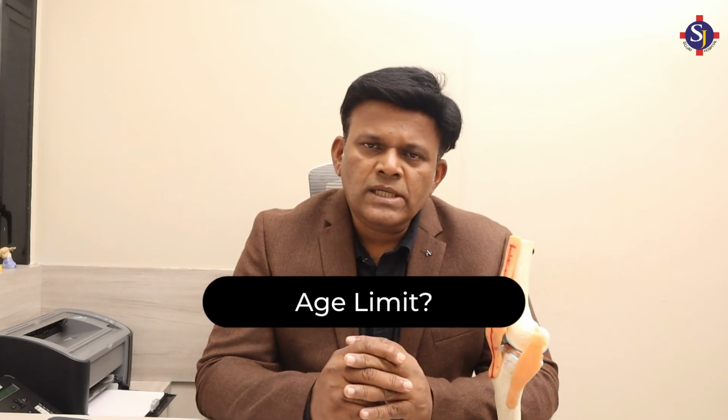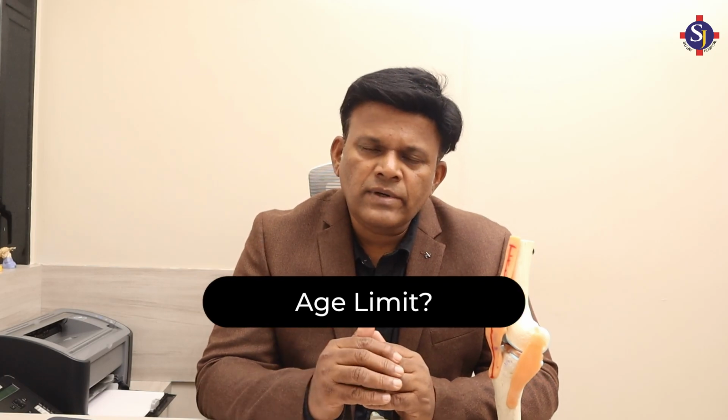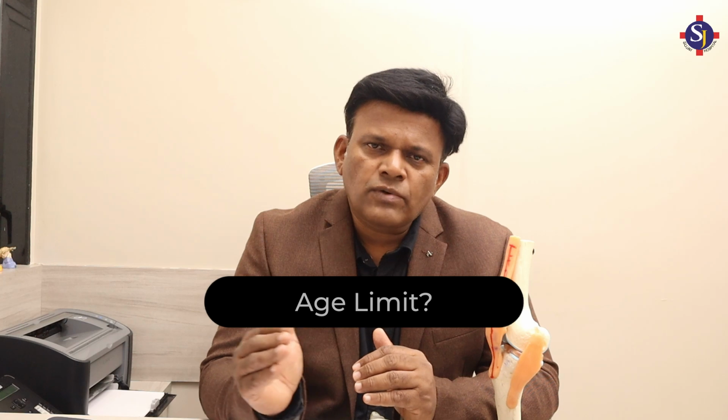Age limit is obvious. There is no upper age limit. We have done surgeries for even 80, 85, 90 year old patients. But for the lower age limit, we generally refrain from doing knee replacement surgery under 50, unless there is a pressing need because the patient is really disabled. And even in those patients, we try to get away with a unicompartmental, that is partial knee replacement surgery.